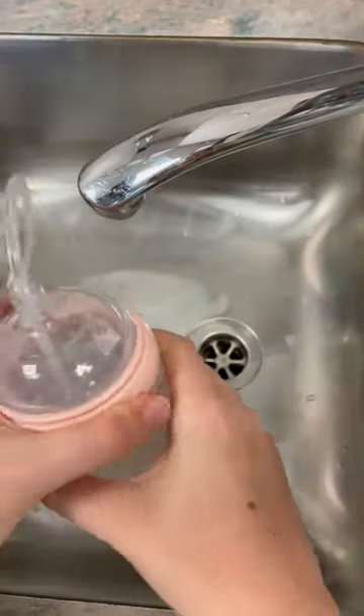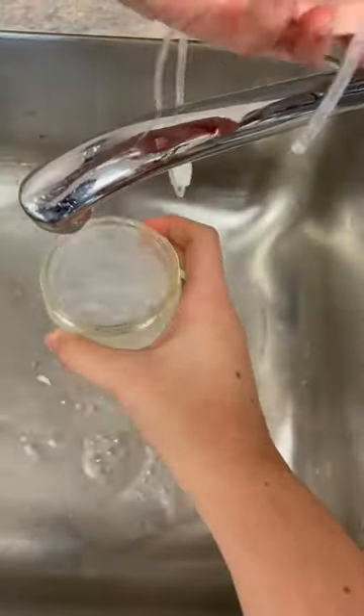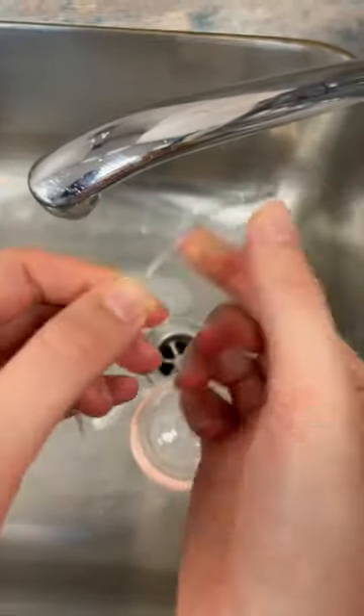Cleaning the Harka silicon feeding tube set is easier than you'd think. Simply fill the bottle with warm soapy water and give it a good squeeze to start the flow, just like you would when feeding. Now flush the tubes with the soapy water and then with just plain water until you've got all the soap residue out. You can repeat these steps again if you need to.